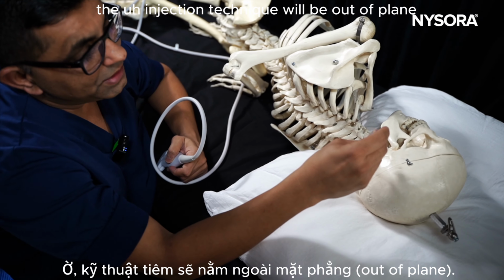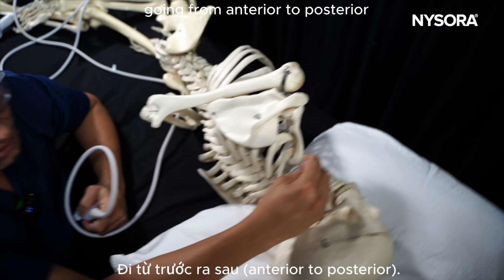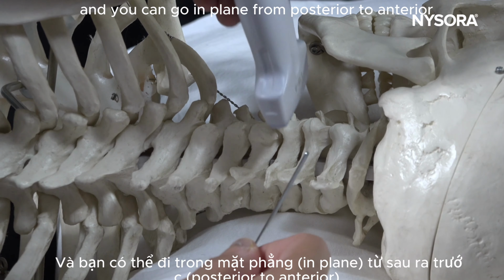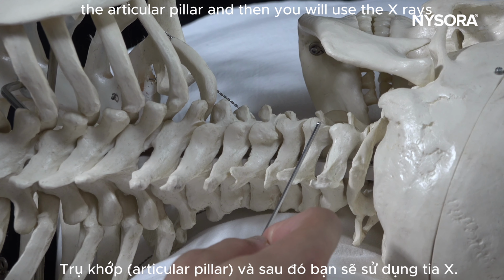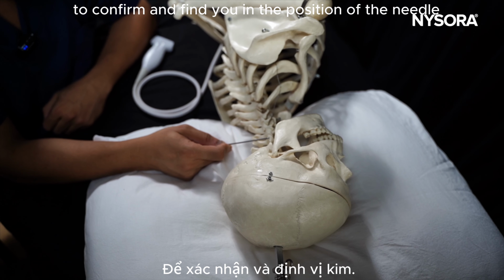The injection technique will be out-of-plane going from anterior to posterior, or you can do a transverse view and go in-plane from posterior to anterior, landing in the area we call the articular pillar. Then you will use X-rays if you're performing radiofrequency treatment to confirm and fine-tune the position of the needle. Thank you.